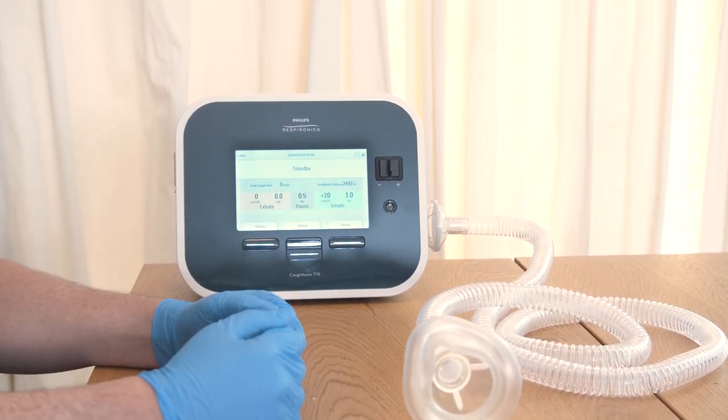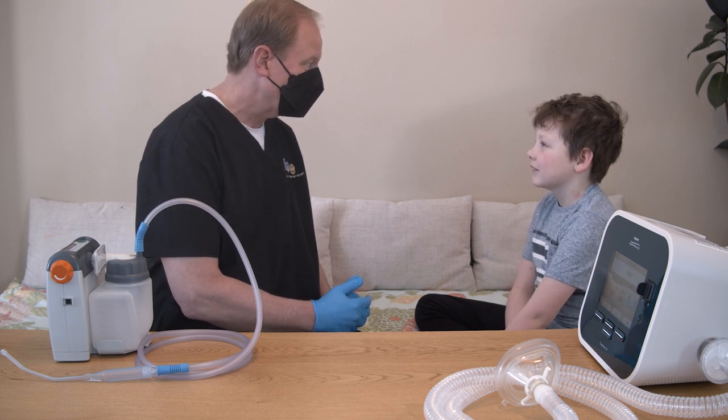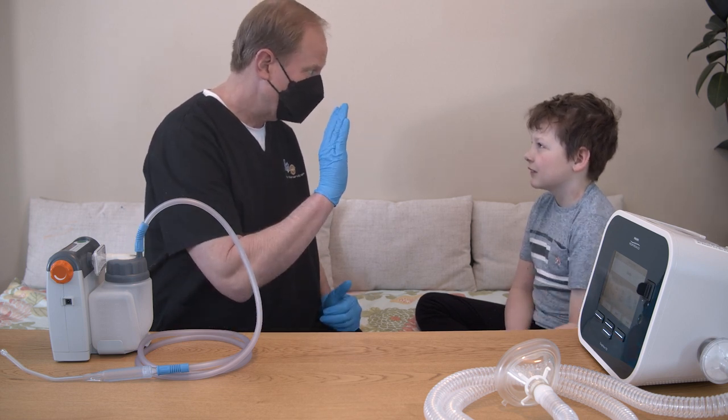Push the standby or pause button. If your child can communicate, figure out a signal that they can use if they need to stop the session.